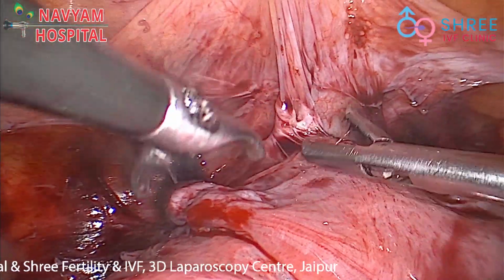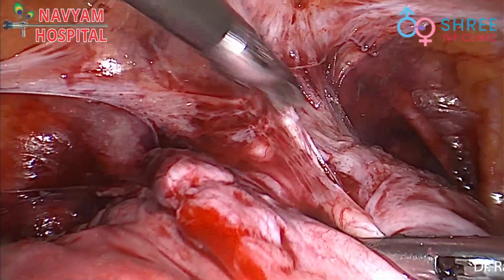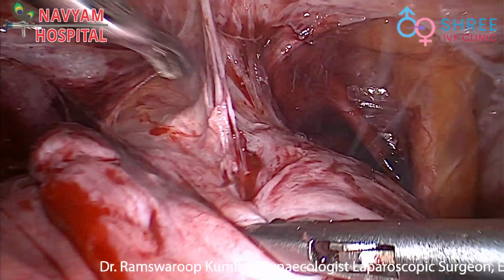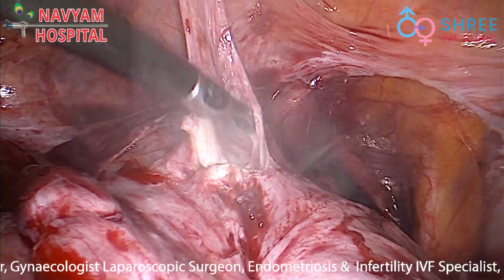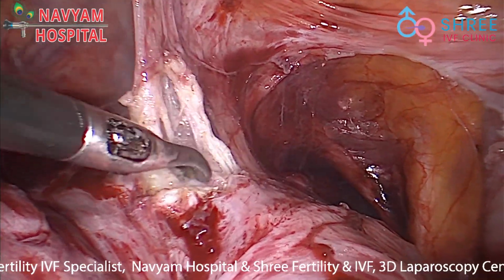After holding and giving traction to the bladder on the anterior side, gentle cuts are made, trying to find a proper plane. This is the dense adhesion band and we have to cut only it. And we got a proper plane between the bladder and the cervix.